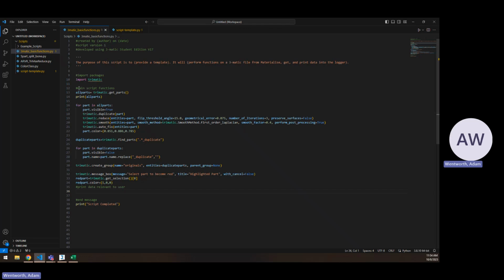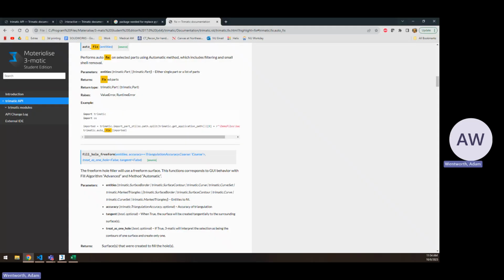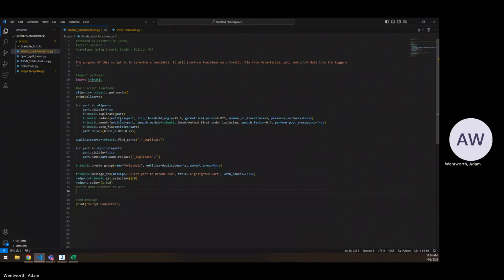Those functions are finding parts, getting a list of parts, printing functions, running a for loop on the list, grabbing some functions in the API just by searching for those. After we search, we put in the variable names that we want to run those functions on. Coloring a part, finding parts. So if we want to find parts with something in their name or by a specific name, we can do finding parts plural, and we can use regular expression.